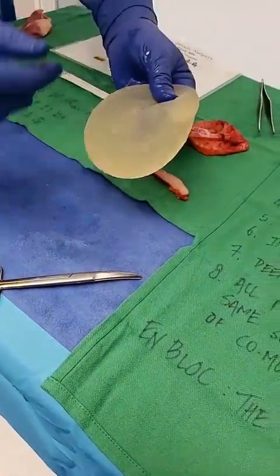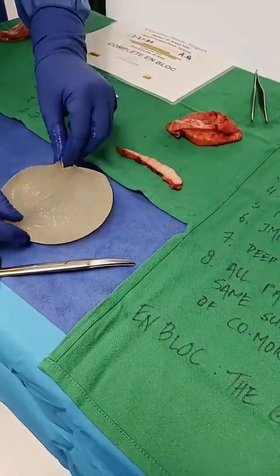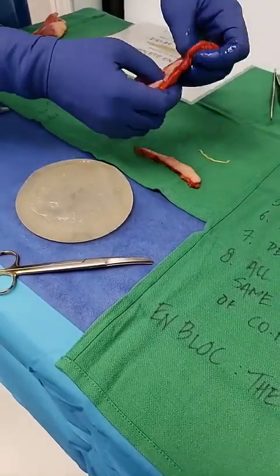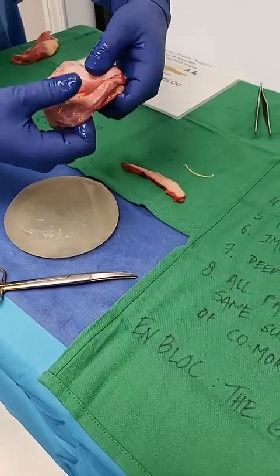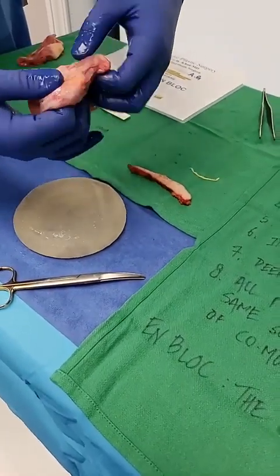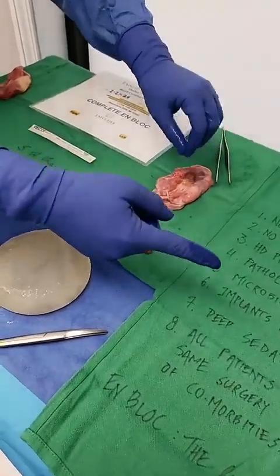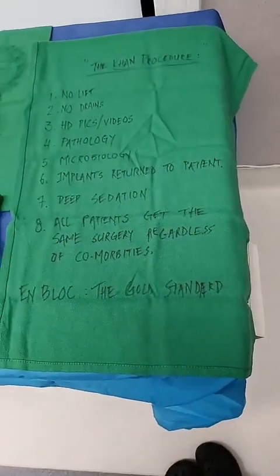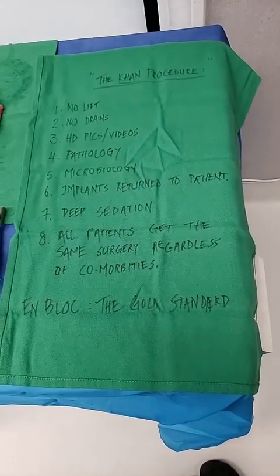Now I will tell you, I'm going to change my gloves and I'm going to go back into that. I'm going to send this off. So you see, look at all this fluid around, and again, a capsule that is very much thin, and very thin capsule. You can see my blue glove, and no matter how thin, the entire capsule tissue must be removed. Now you can focus here till I get another pair of gloves, and then I want to look at the inside of the right one. I'm going to get a new pair.